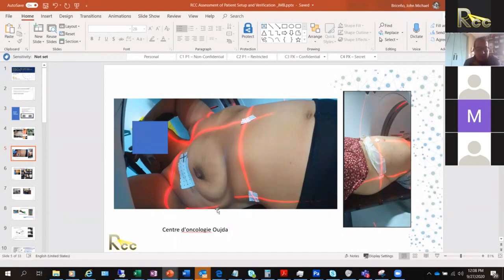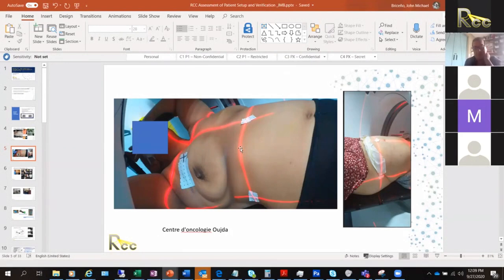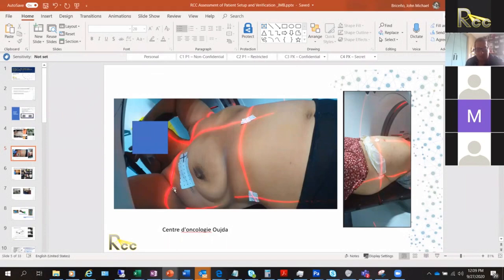Do you use wires to set up the boundary fields of the breasts? Yes — those are the large marks visible in the image. This is a great example of how to set up breasts on simulation. It's important for the therapist to have a midline plane to align the patient to the center of the table, and to have lateral BBs so you know the level to raise the table. You also need to account for your immobilization devices such as the breast board.